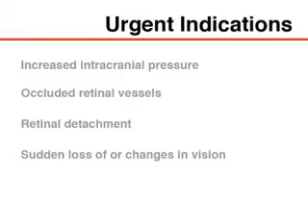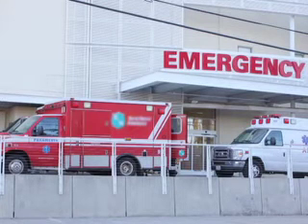Urgent indications for direct ophthalmoscopy include clinical suspicion of increased intracranial pressure, occluded retinal vessels, and retinal detachment. Any of these conditions or sudden changes in vision constitutes an ophthalmic emergency. The patient should be seen by an ophthalmologist immediately or should be sent to the emergency department.